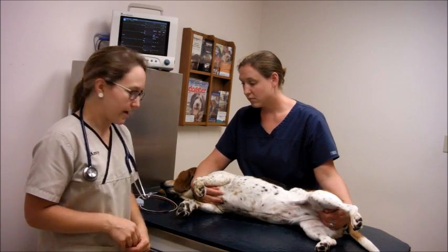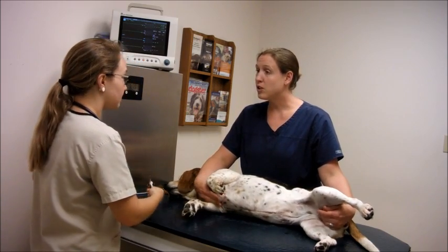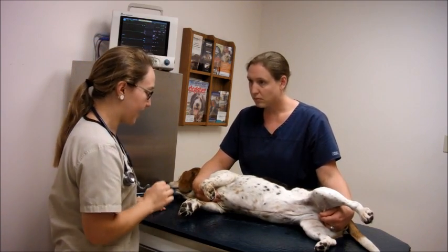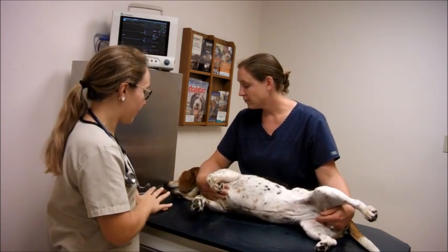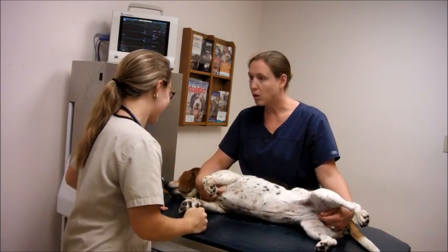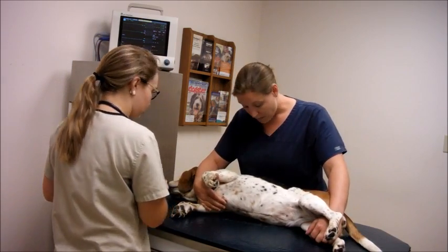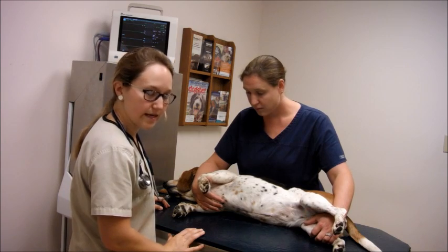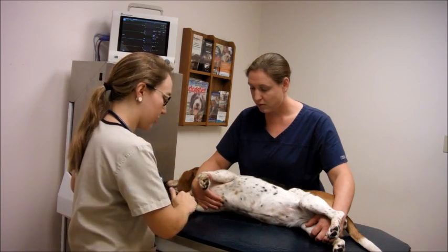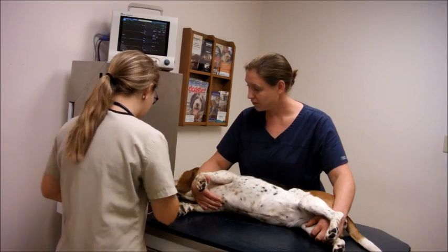I'm going to go ahead and get started. I have my leads here — a black, red, and white lead; I'm just using three. She's going to be restrained in right lateral recumbency so that when I put the leads on, everything's parallel. A trick one of the doctors taught me: when thinking of where the leads are placed with the right side down, you go from the right — snow over grass, so white and green, and then smoke over flame, so black and red.